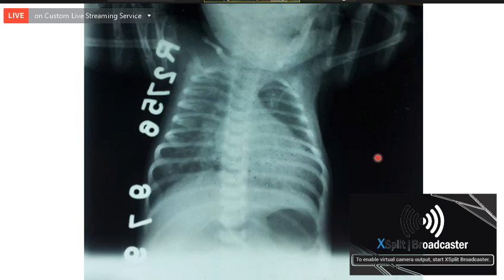Why do you say that? What is narrow? Narrow pedicle. The pedicle is very narrow. The narrow pedicle does not go with total anomalous pulmonary venous drainage. No, wrong. So whenever there is a narrow pedicle, what are the conditions you get? TGA, very good. Transposition of great arteries. Because in transposition of great arteries, two vessels are placed anteroposteriorly, which can produce the narrow pedicle.